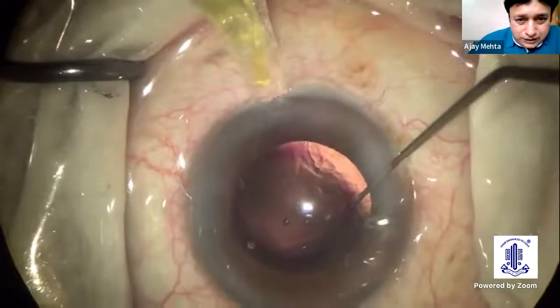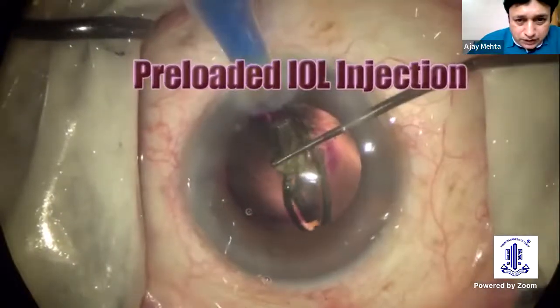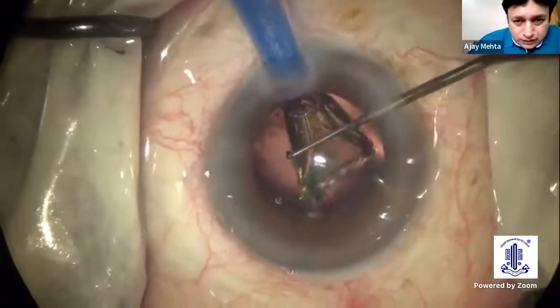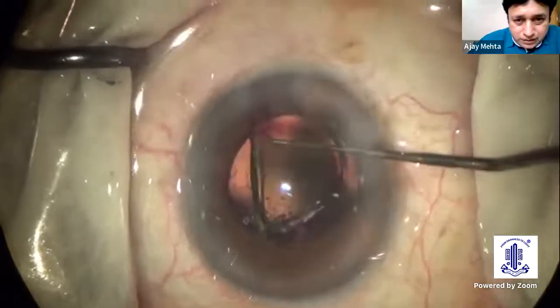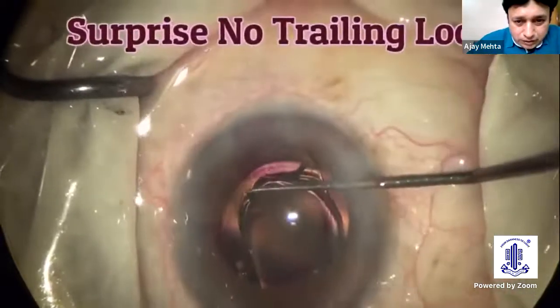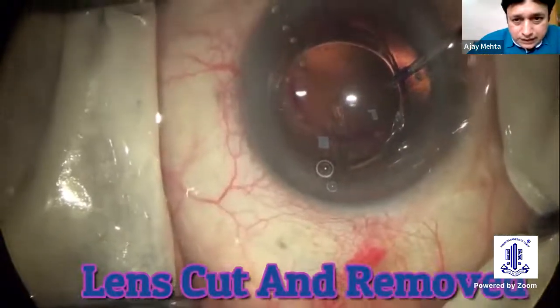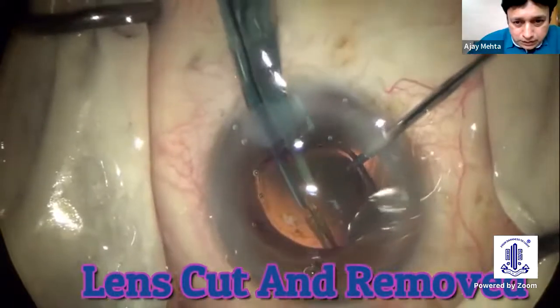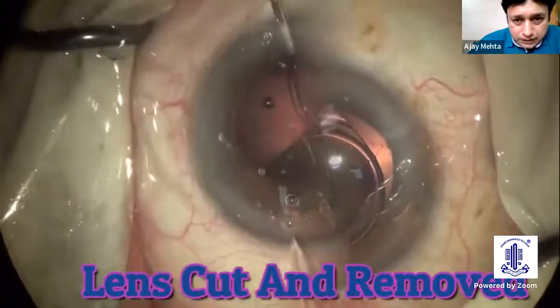And now I started injecting the preloaded IOL. Then a lot of froth came out from the IOL injection. And then what I noticed at the end, to my surprise, was that the trailing loop was not there. This shocked me a lot, but I was ready for this event. So I introduced micrograspers on one side, and I had already acquired a special IOL cutting scissors, which is very sharp, and I could split the lens into two parts.